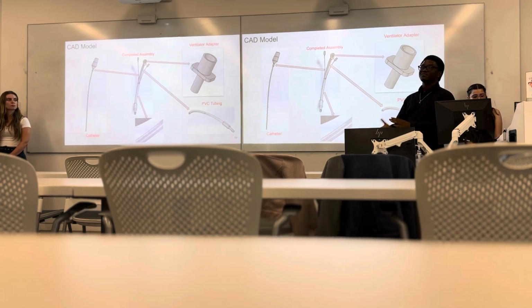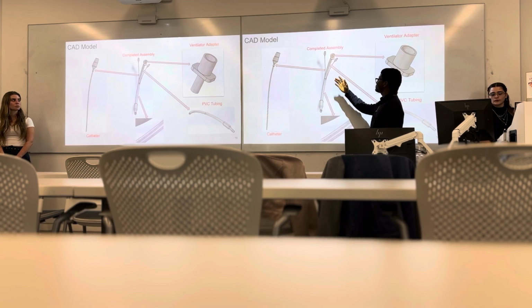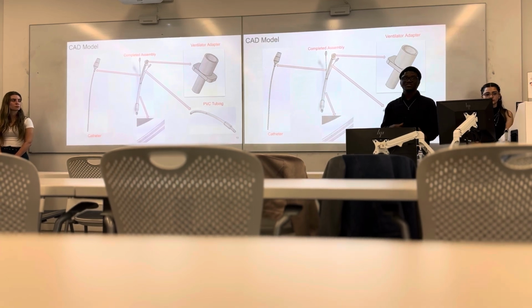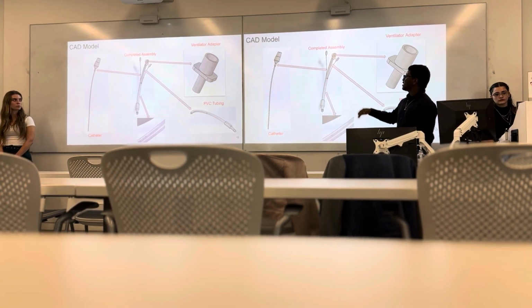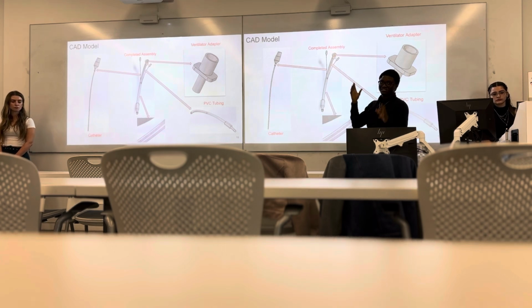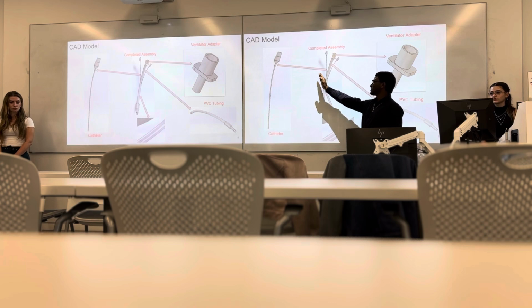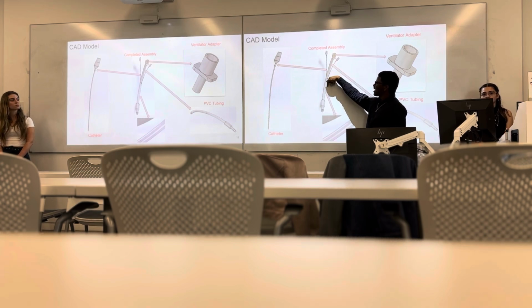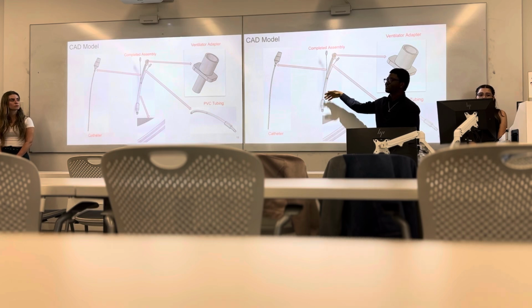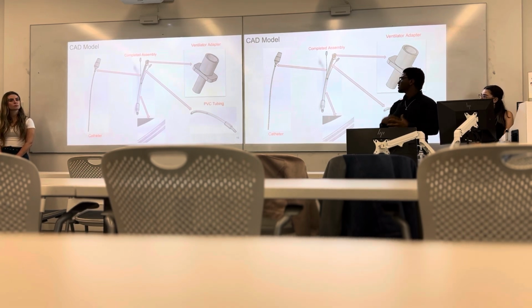So once we had the math model finished, we then proceeded to CAD, having decided on an idea, for visualization, as well as to verify that it was actually feasible. As you can see, this was our prototype. The idea was to basically keep the tube as it is and shift the current port 90 degrees to the left and add our new port where the current port is, as well as put the 5 holes over here. That way when you insert it into the person, gravity kind of helps spread it out as well.